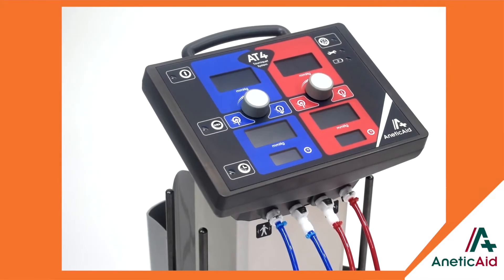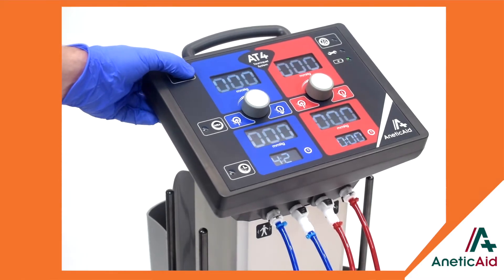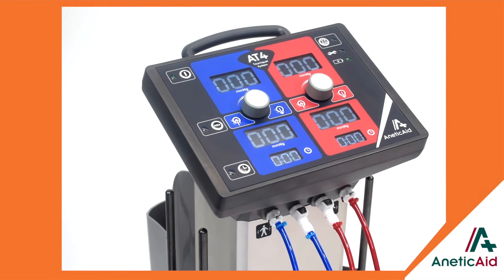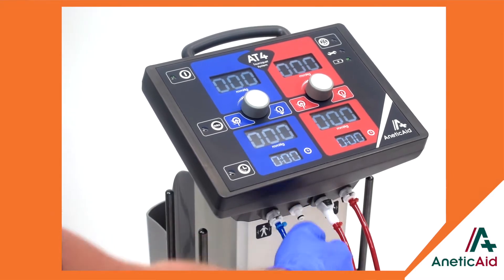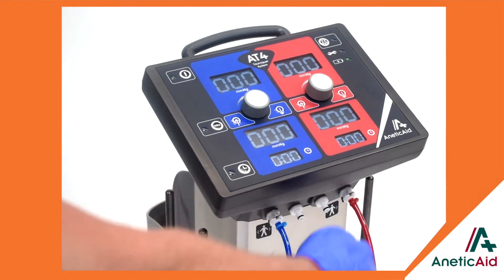Truly independent, the AT4 is a battery-powered device, which means there is no need for trailing mains leads or a medical air supply connection. With a battery life of around 16 hours between charging cycles, based on average use, it also has an air reservoir which is maintained by its internal pump.